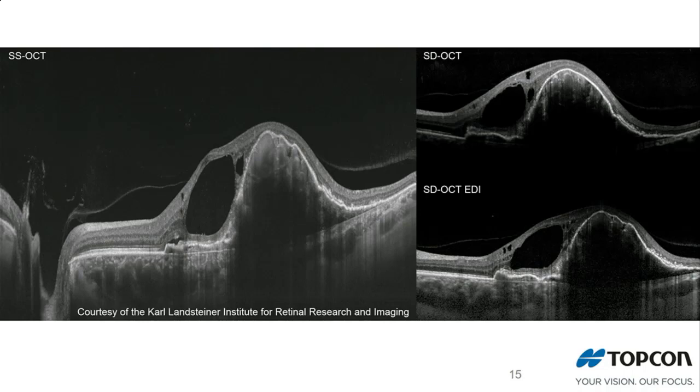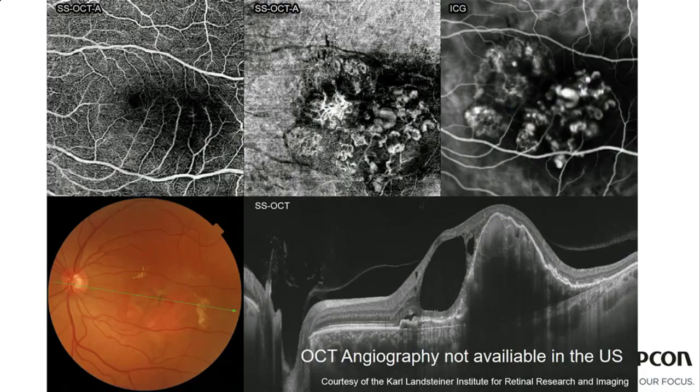But in the meantime, and that's important for you guys, we've created a self-propagating segmentation override. So you draw this line once, and then it propagates it through the lesions. So correcting it can go very fast. So doing that, we got this image.